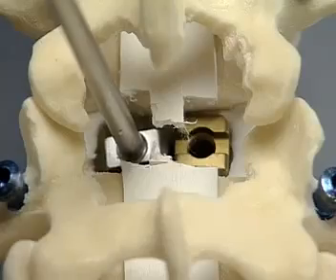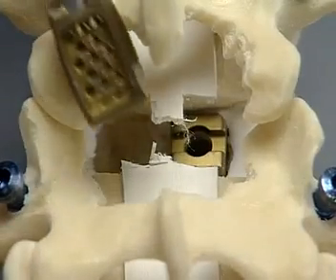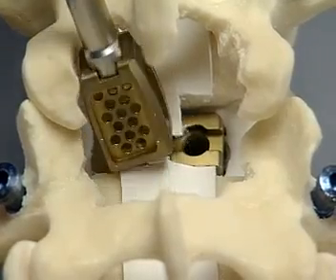The vertebral body spreader is removed from the opposite side and the appropriate size contact fusion cage is inserted as shown before.